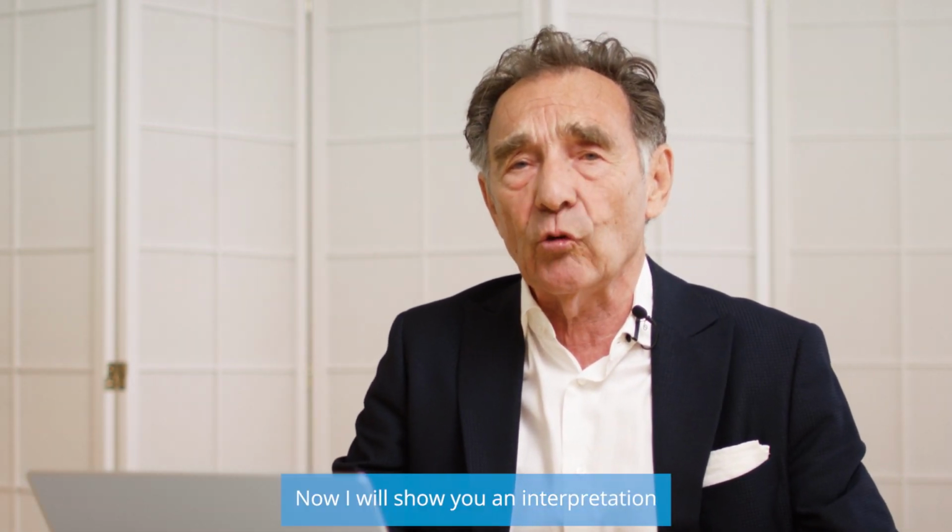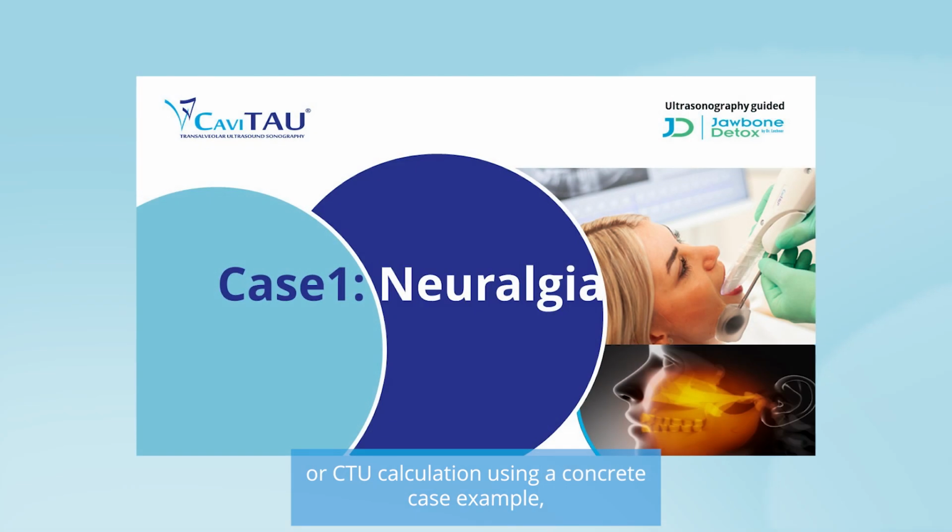Now, I will show you an interpretation or CTU calculation using a concrete case example. A case example of a trigeminal patient from our practice clinic.